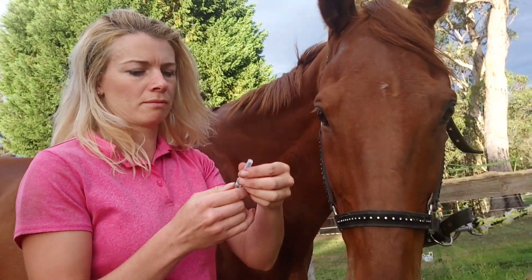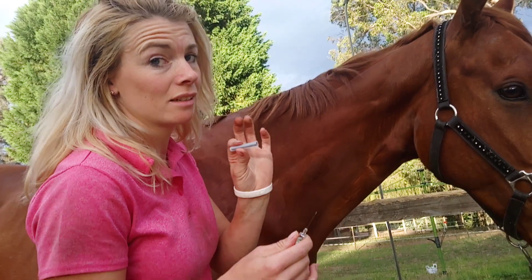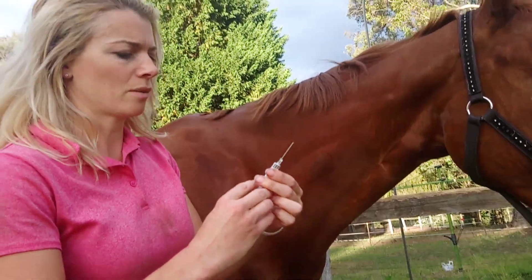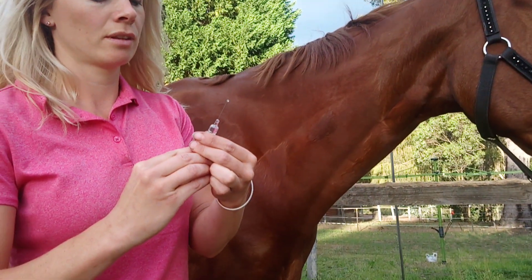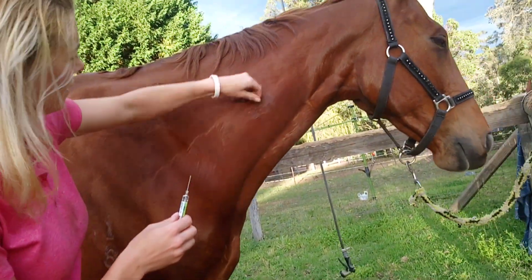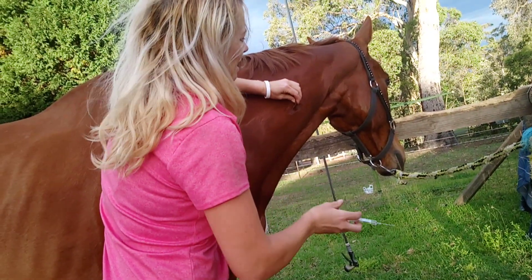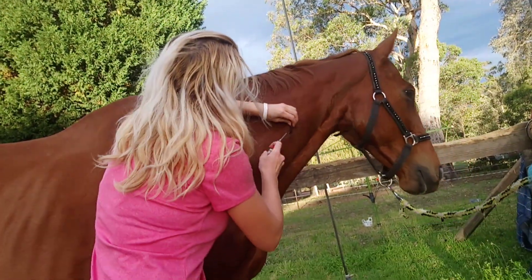So take our injection. Keep a hold of your lid, because you're going to stick that on at the end to keep the needle safe from hurting anybody. We're going to squeeze the air out of it, and then we're going to take that site there and inject under the skin.